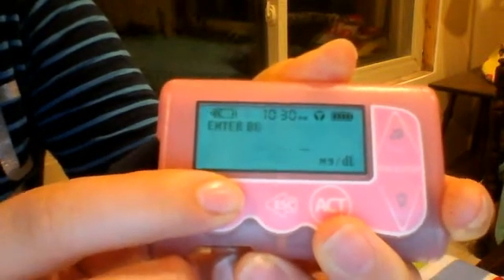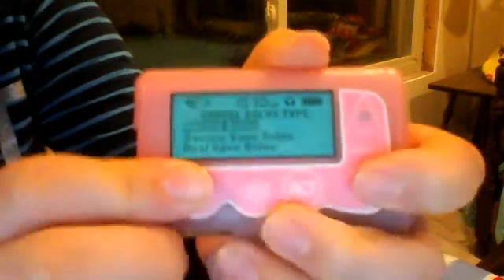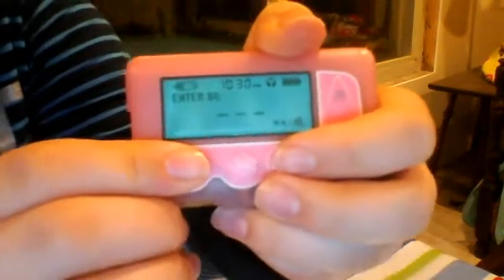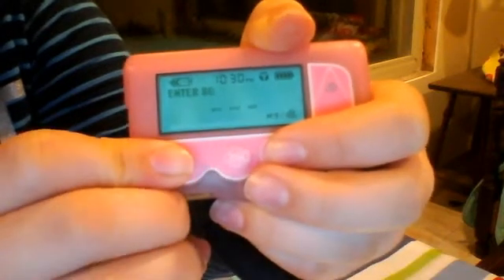And if you don't want to use the bolus wizard and you want to do a manual bolus, you just click it again. You can do it like that, or you can go back to enter BG. So you test your blood sugar, you enter BG, and then it would go to your pump and it would show up here.